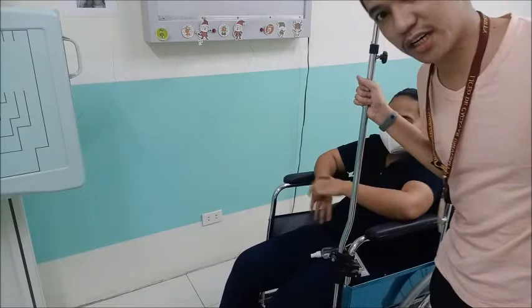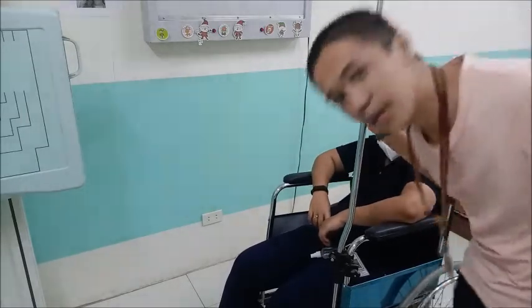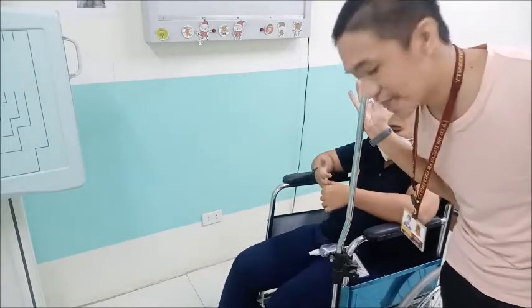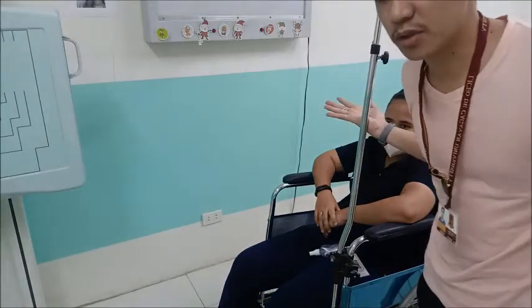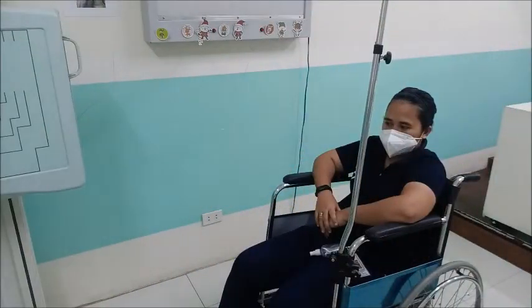So if naka-wheelchair ang patient, some of the patients can actually stand. Ikan pa sila sa emergency room. So some of the patients can actually stand. So you have to always ask the patient and then assess the patient's mobility. Okay? So, there are some kanang pwede silang tindog but with assistance. And then, some can actually just stand up on their own. Bawal maglakaw ang patient pasaka towards sa ilahang room.